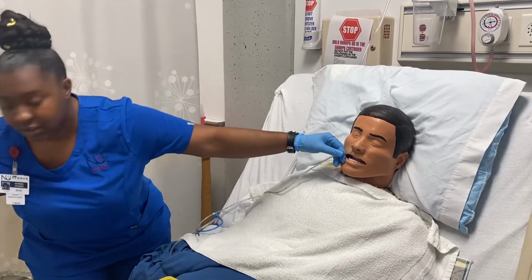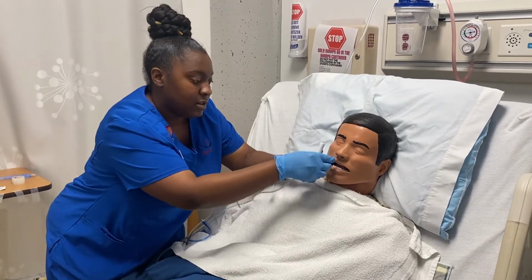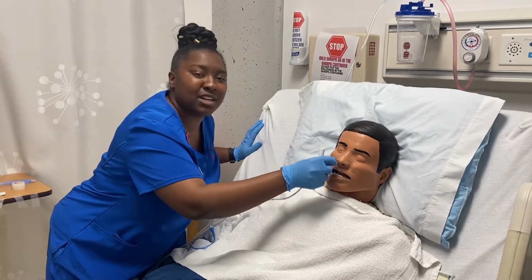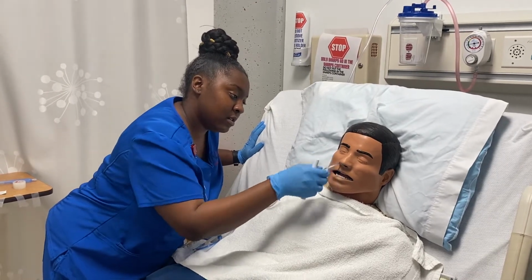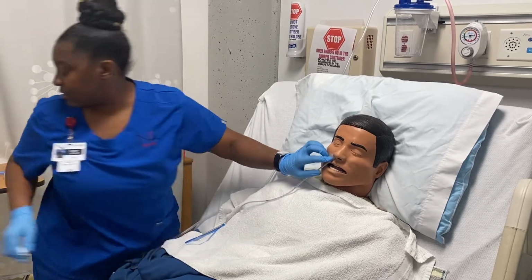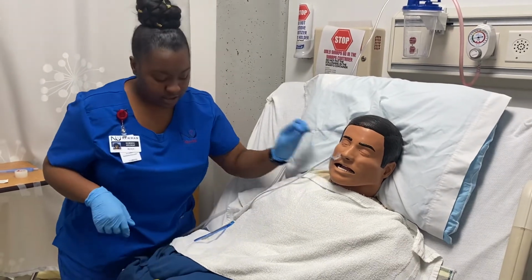Perfect. I'm also going to check to make sure it's not coiling in the mouth. And if I feel a little give, I kind of want to stop a little bit and make sure that it's going down fine. Okay, perfect.